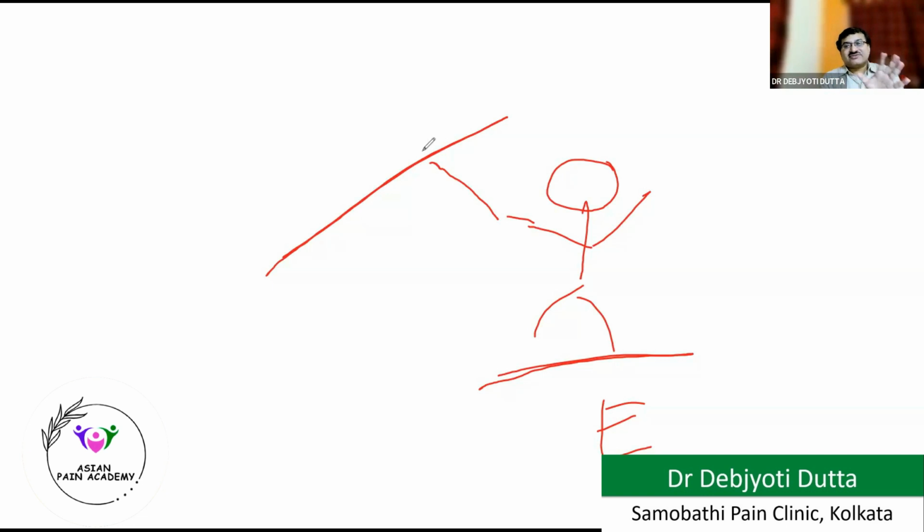Cardiac event does not occur first. First is the nervous event, and usually he will get the sensation of shock in the nerves. Then in severe cases, he might get a cardiac arrest as well. So these are the physiological effects. But apart from this, the person might get a burn in the finger. Why this burn? Because of the thermal effect of the current.